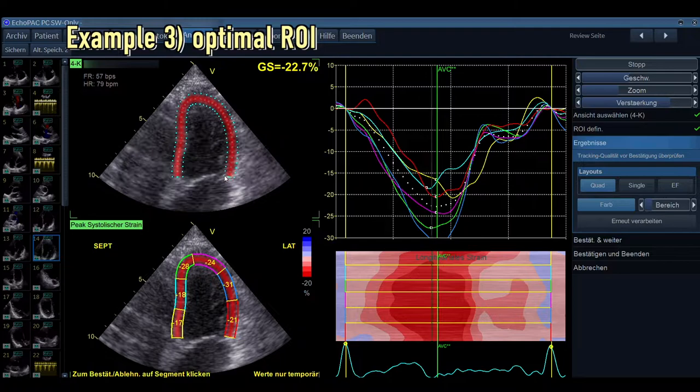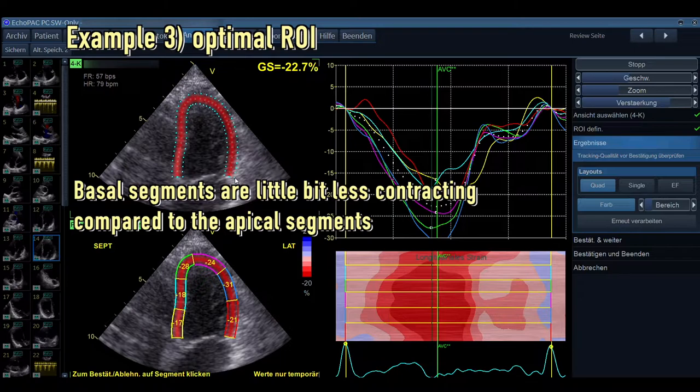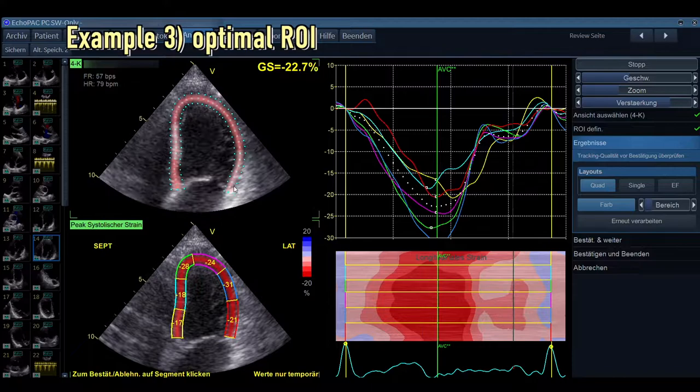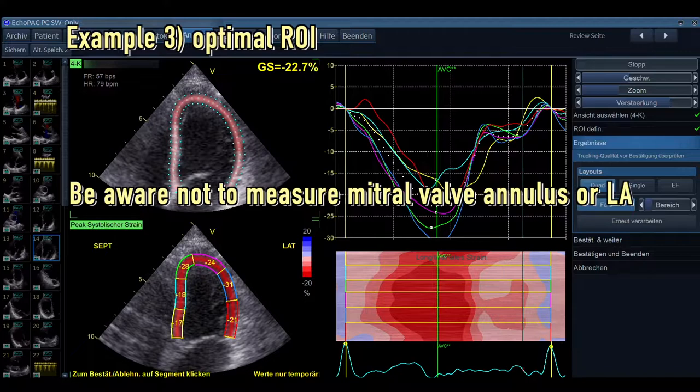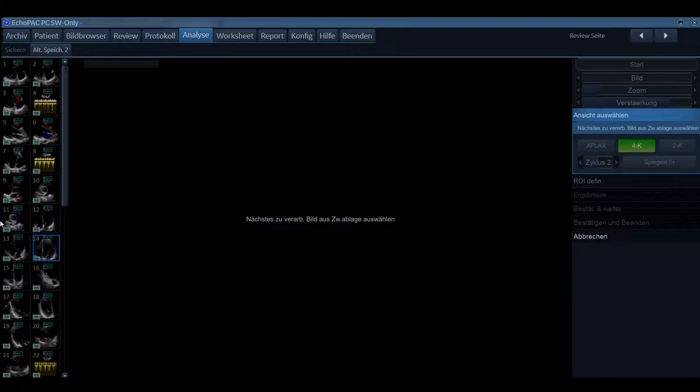Why is that? Always the basal segments are a little bit less contracting compared to the apical segments. But if you just put it more down, you are tracking the mitral valve annulus, which is just firmer tissue compared to the myocardium. So you have to be aware to not measure the mitral valve annulus or the left atrium even in this view. So we also take this measurement so we can continue with our next measurement and apical three-chamber view to succeed in all the measurements.